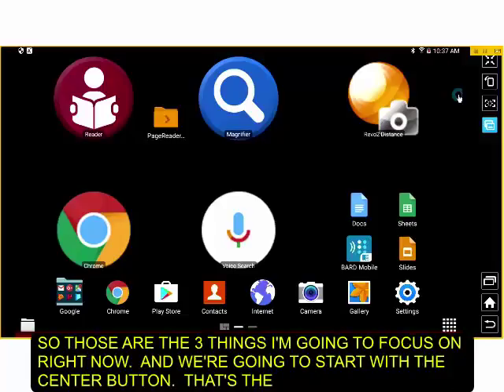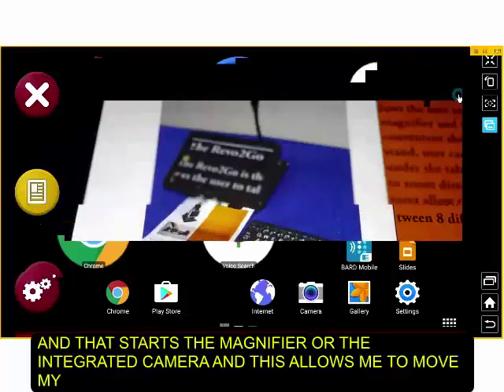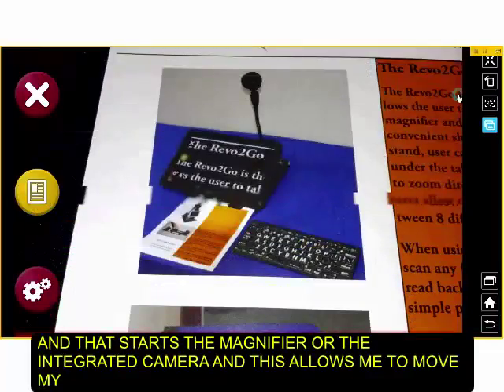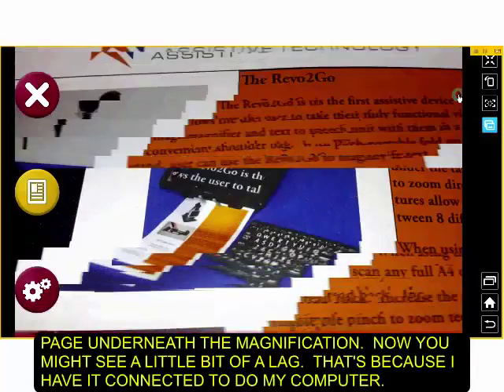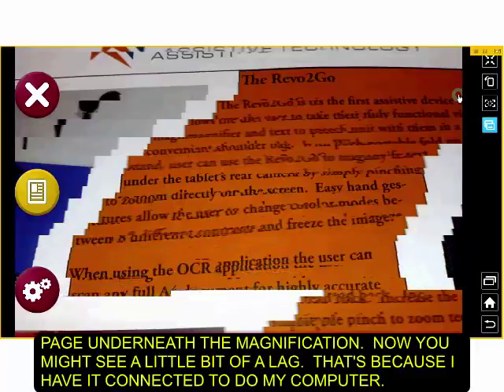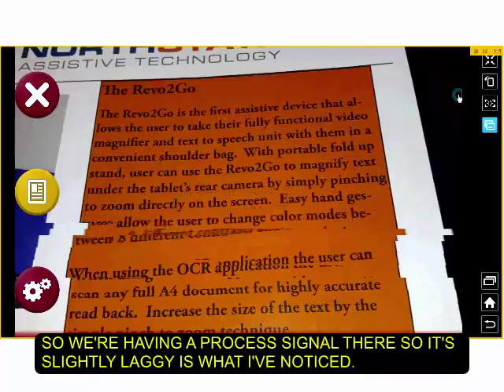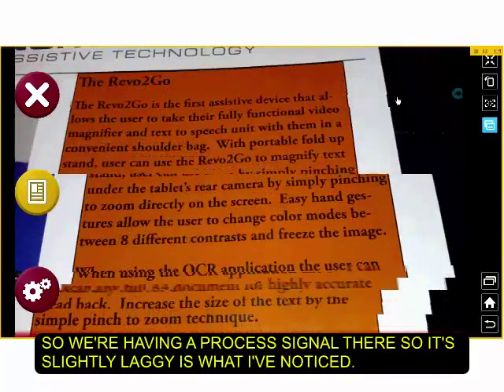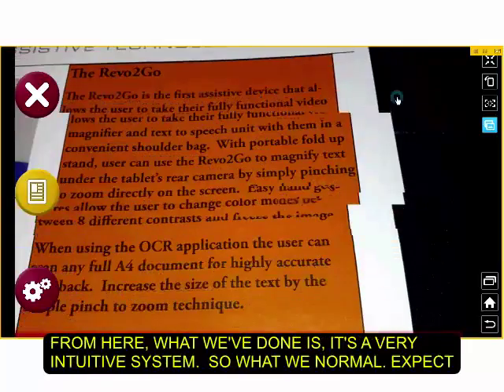And we're going to start with the center button. That's the Magnifier app. All I do is I simply touch that, and that starts the magnifier or the integrated camera and allows me to now move my page underneath the magnification. Now you might see a little bit of a lag. That's because I have it connected to my computer, so we're having a process signal there. So it's slightly laggy is what I've noticed. Just making sure my computer doesn't go to sleep on me.